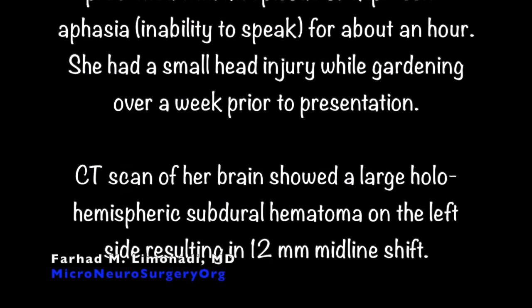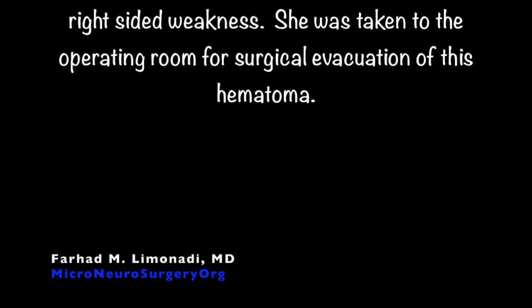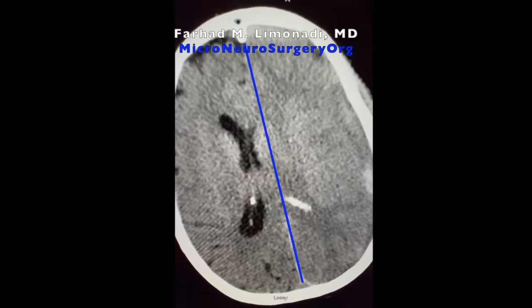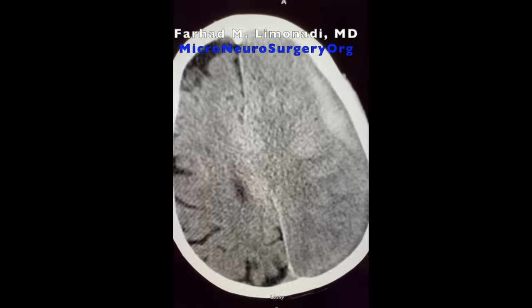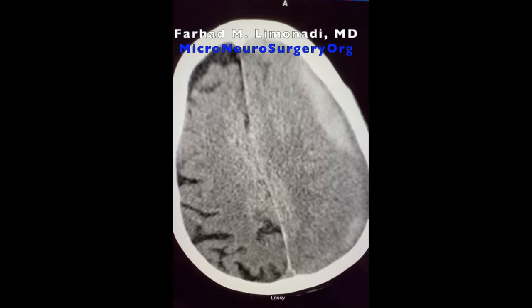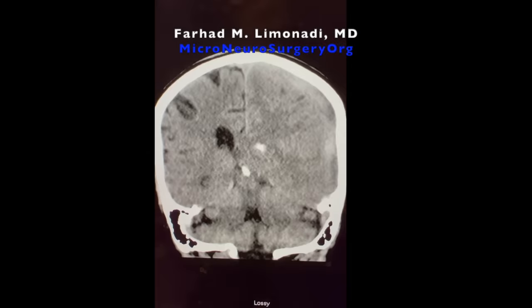This is a case of a 72-year-old lady who presented with an episode of expressive aphasia for about an hour. She had a small head injury while gardening over a week prior to presentation. CT scan of her brain showed a large holohemispheric subdural hematoma on the left side, resulting in a 12-millimeter midline shift. Her neurological status rapidly deteriorated while being monitored in the ICU, with aphasia and right-sided weakness. She was taken to the operating room for surgical evacuation of this hematoma.